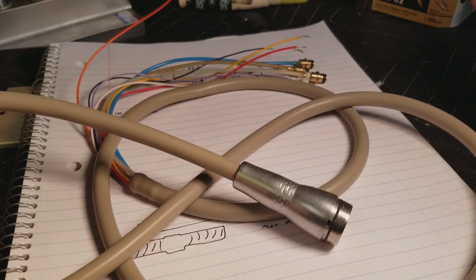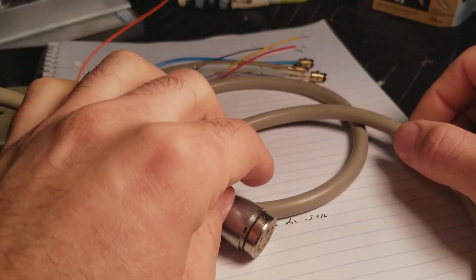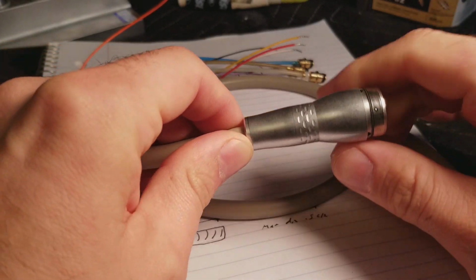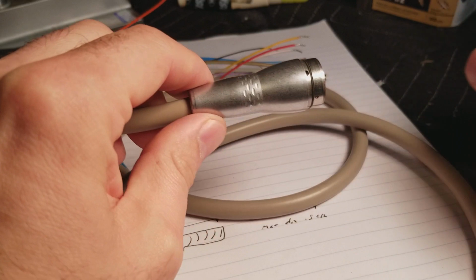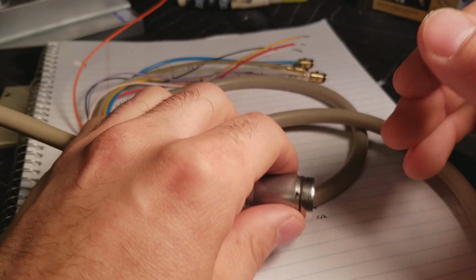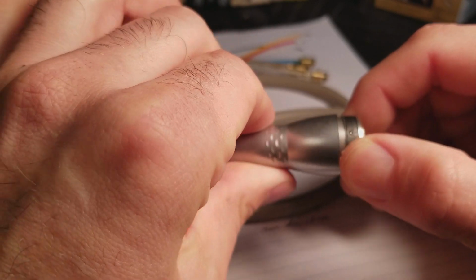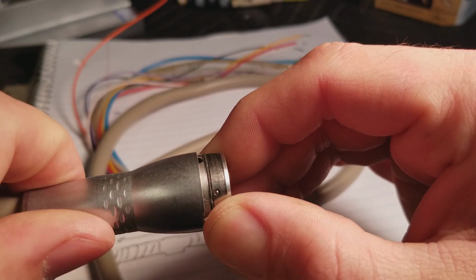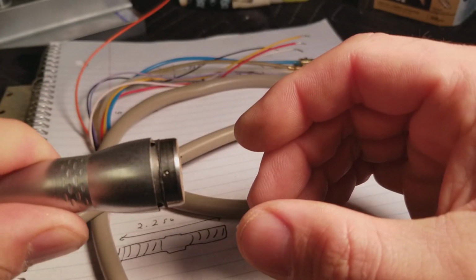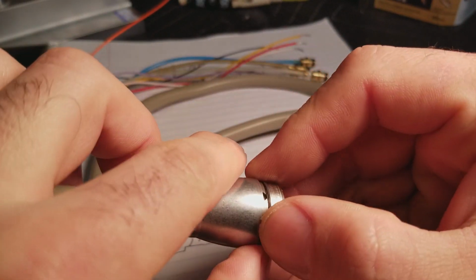So the first thing you need to do is you need to get access to the actual wires inside the silicone sheath. And to do that, we have to take apart this component here, which is the piece that snaps into the electric motor, that then snaps onto your handpiece. So first thing you got to do is I would just take the cable out. If any of you who have actually attempted this and looked at it, you've noticed that this piece just spins and spins. It just simply goes in and out like so, but it cannot actually be unscrewed. Well, this was a mystery to me.